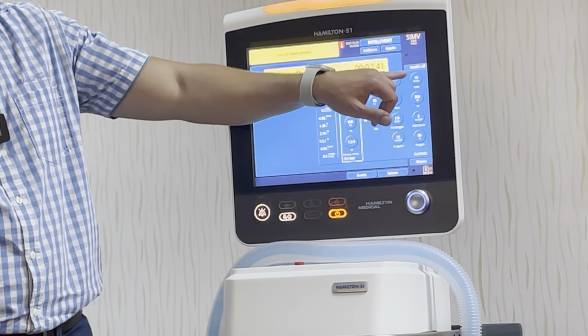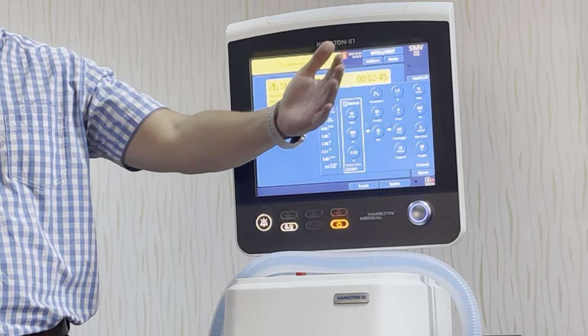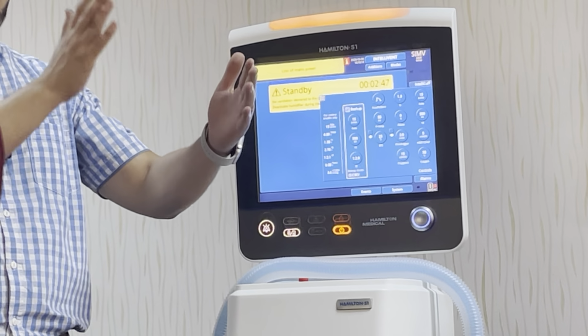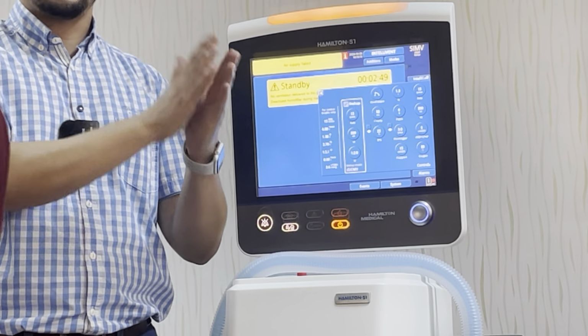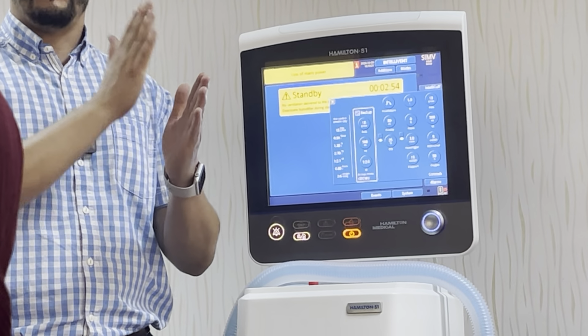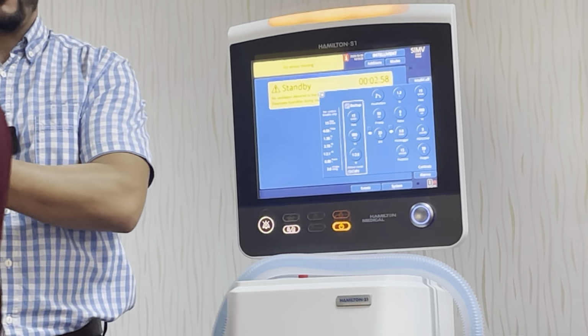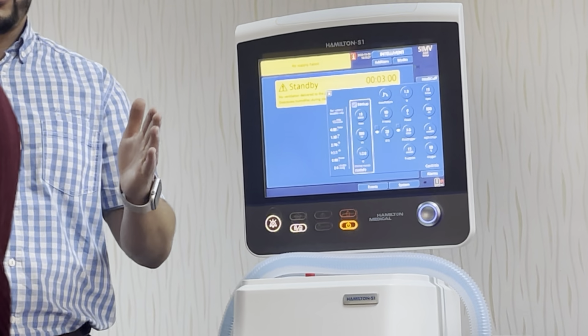الماشين لو نحط لها ريت اوف 15 يعني الماشين بتاخذ 60 سكند بتقسمها على 15. لازم every 4 seconds الماشين will start one new cycle. So every 4 seconds الماشين will deliver a mandatory breath. في الزيرو سكند، في الفور، في الايت، في التويلف، يعني كل 4 ثواني الماشين ويل ستارت.